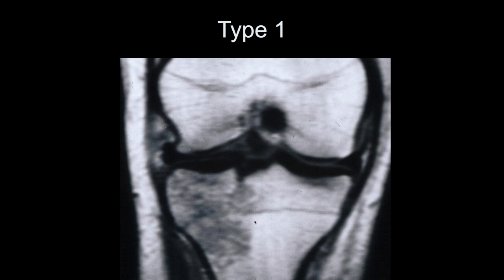We published a study where we basically had 33 what turned out to be trabecular bone injuries, only one of which was positive on X-ray. Many of these patients went to arthroscopy, and some other people in Canada published similar results. The bottom line is these are trabecular bone injuries, which were not really described well before the MR era, because you really couldn't diagnose them by other techniques. They'd be positive on a bone scan, most of them, except in the very acute stages. But with MR, we could really characterize these much better.